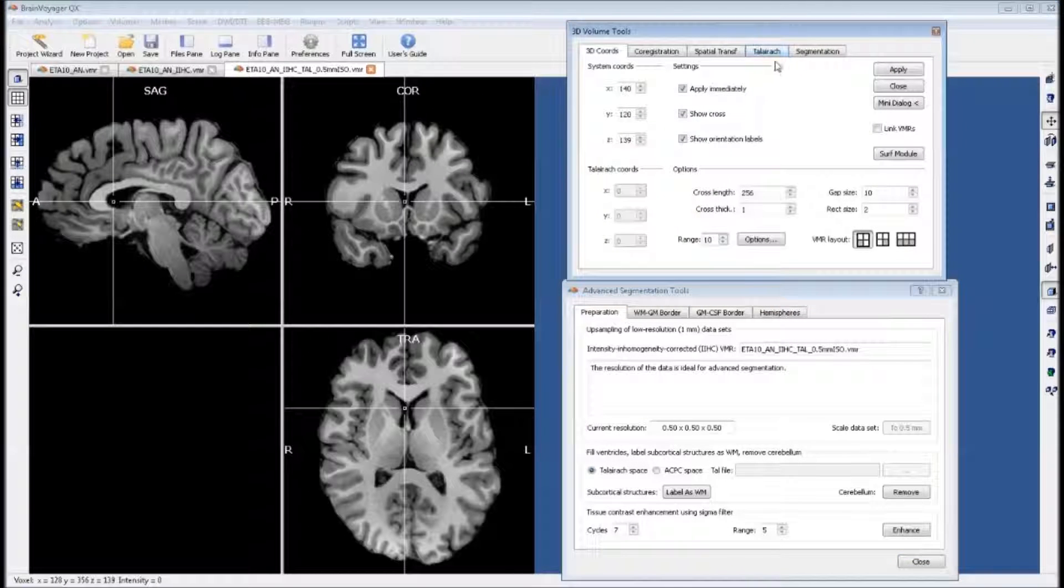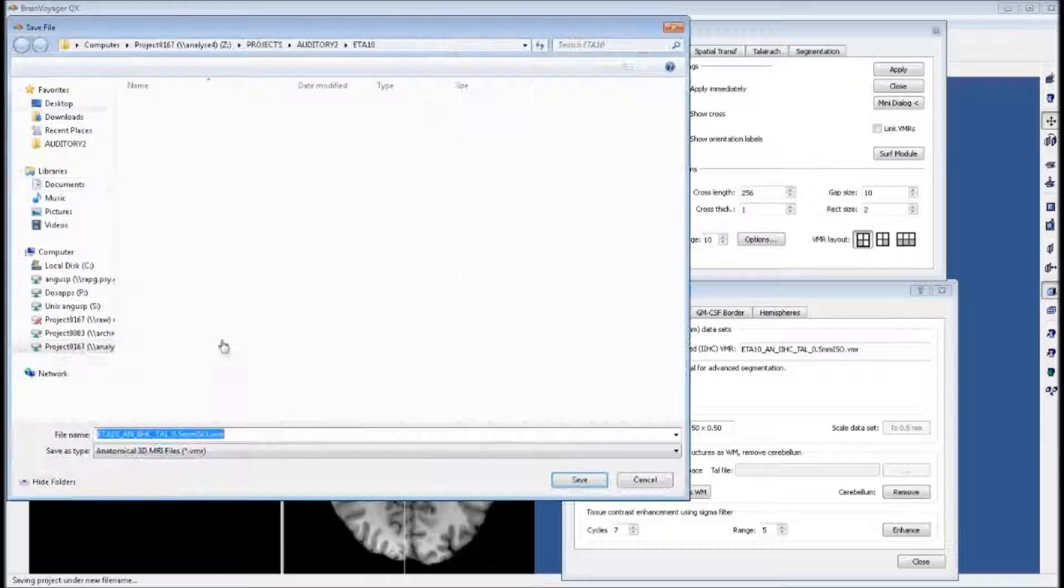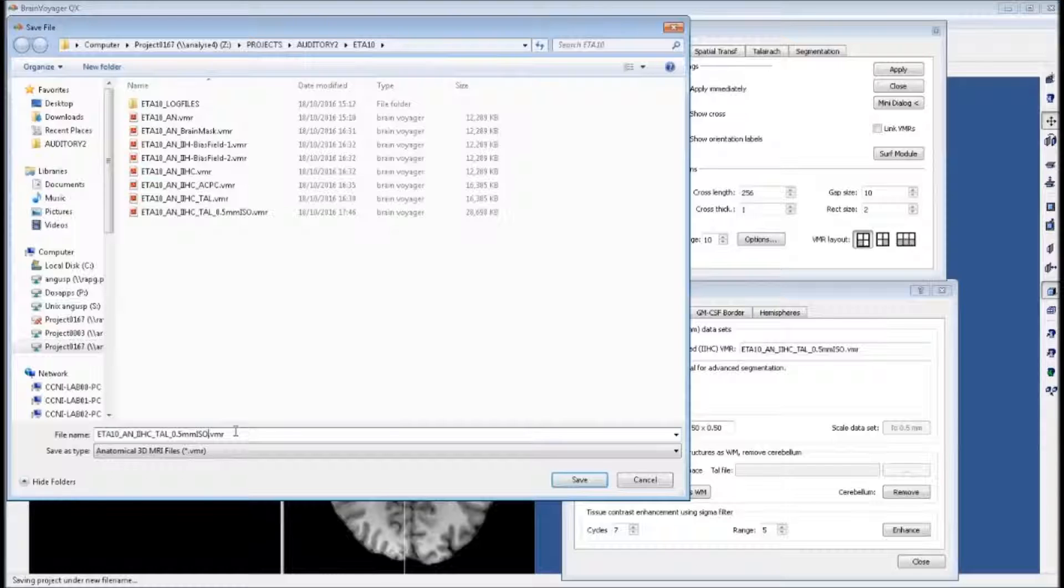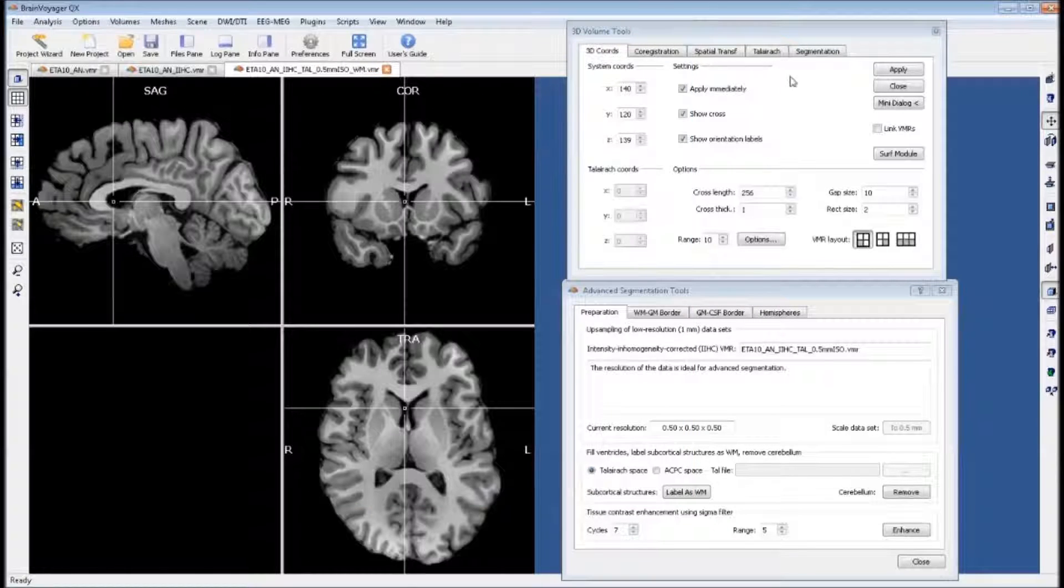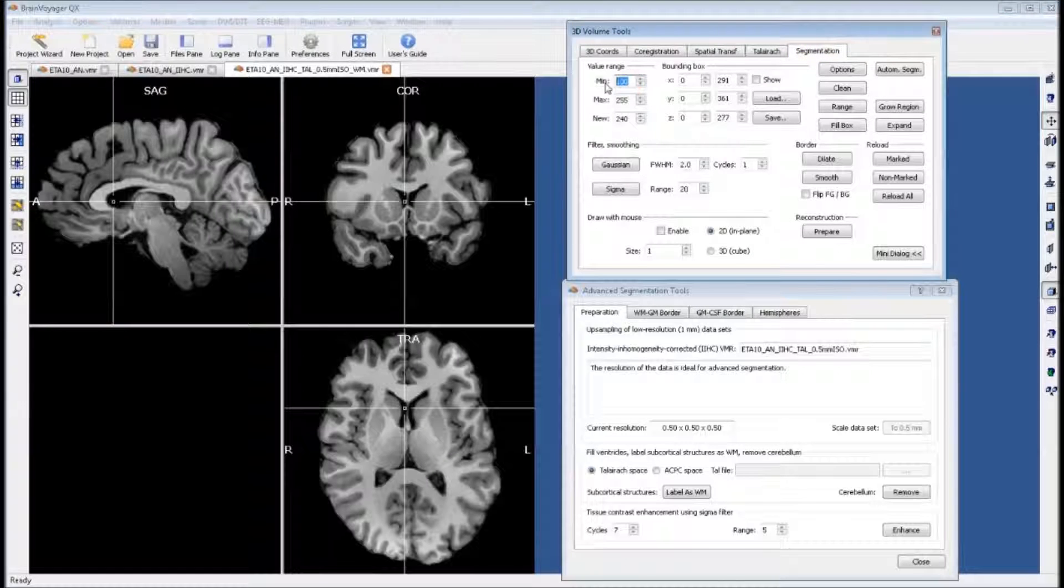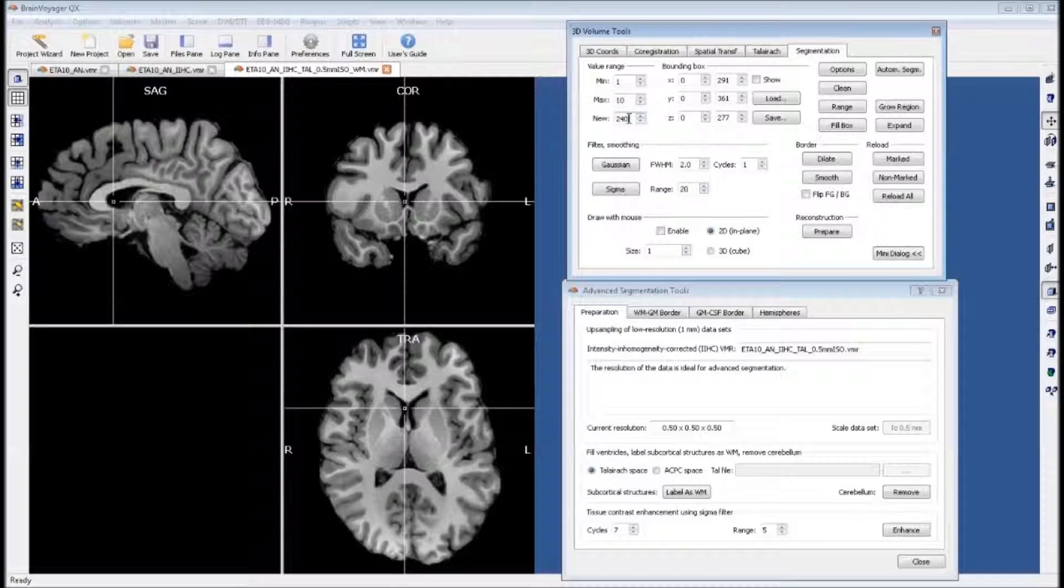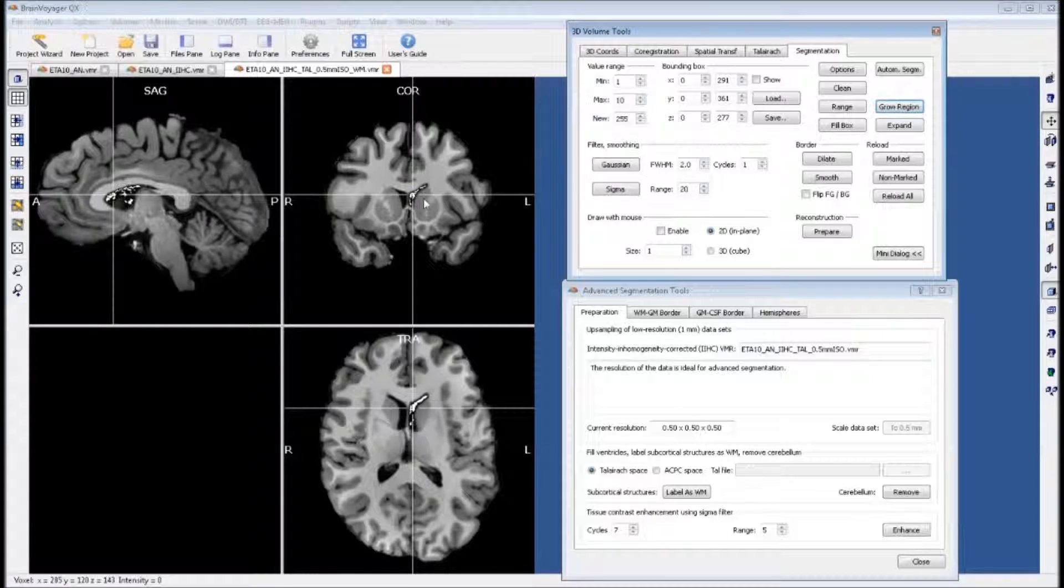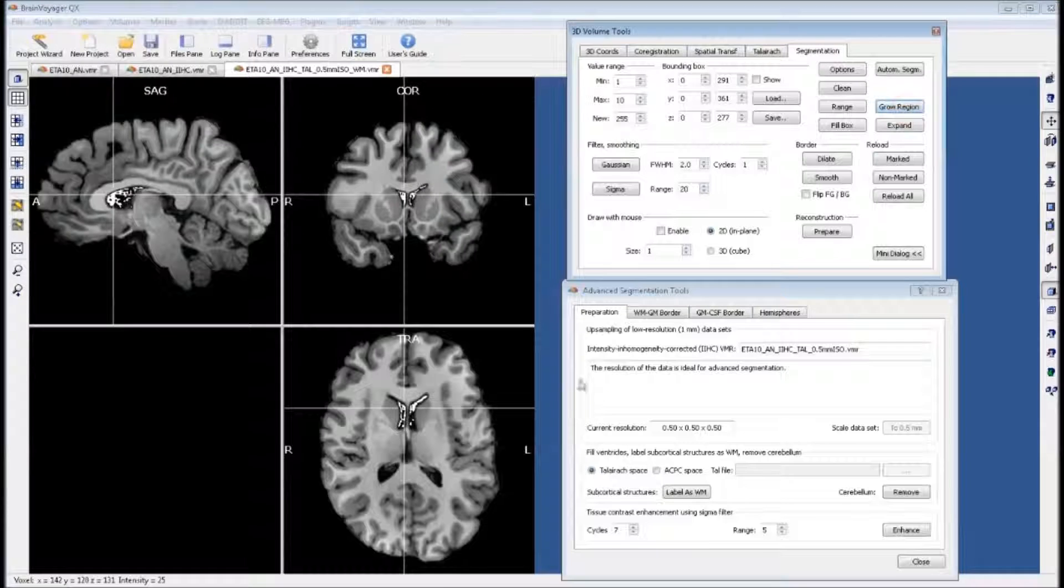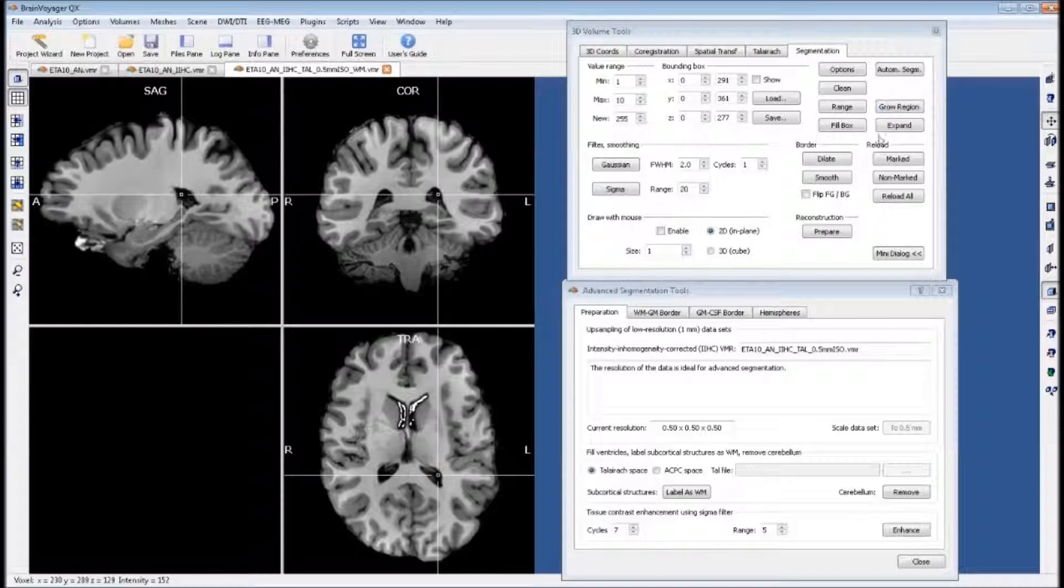For this we will need our 3D volume tools window. We want to save a new version of this file because we're going to be drawing on it. Go to the segmentation tab. We change the minimum value to 1, the maximum to 10, and the new value to 255 which corresponds to white. We click on one of our ventricles and click grow region. Click on the next ventricle, grow region. Repeat this process for each ventricle.